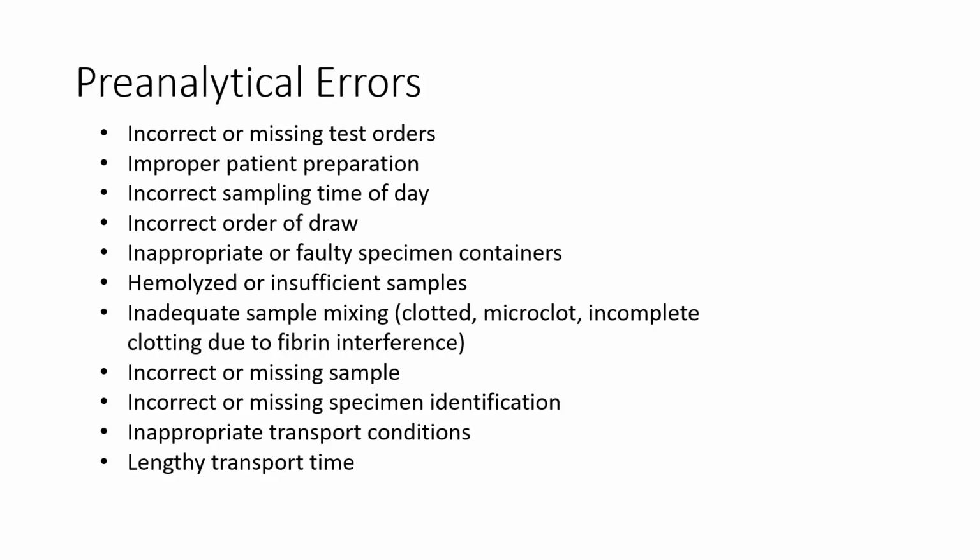And it's not good to report results on the incorrect patient. So you want to make sure that the tube is labeled appropriately. You can confirm that that is the patient and do those checks and balances before analyzing results and reporting those results to the patient.